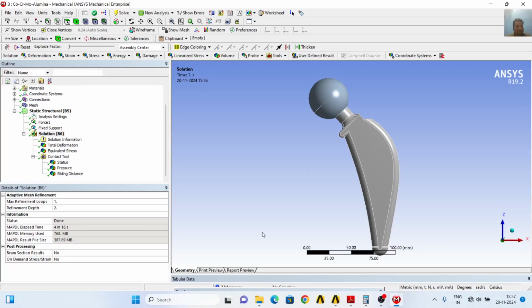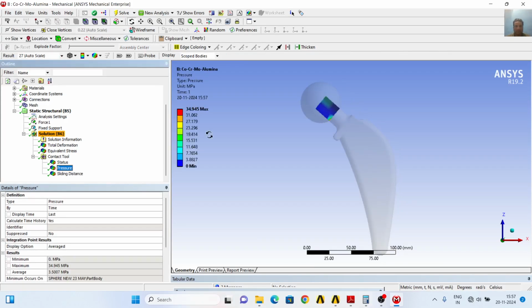So friends, the analysis has been done, and you can see that the contact pressure is known to us, and this is 34.945 megapascal. This is contact pressure, and below you can see the sliding distance between these two parts, which is head and stem. This is 0.00438803 maximum. So in this way we have known the contact pressure and sliding distance between these two sliding parts, head and stem of the hip implant.